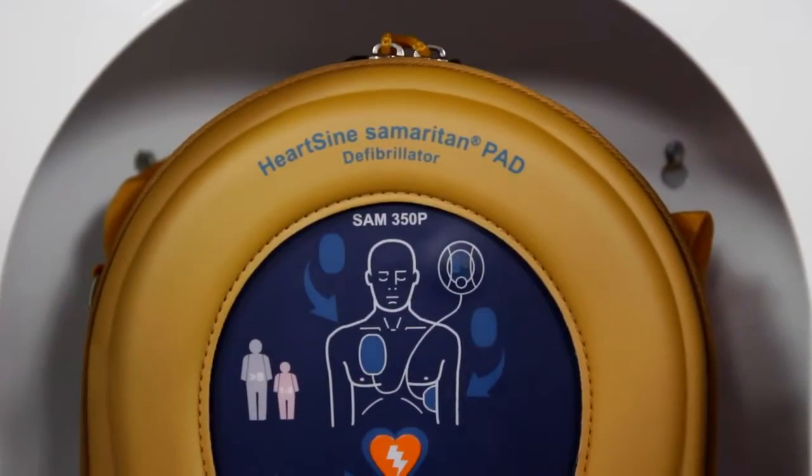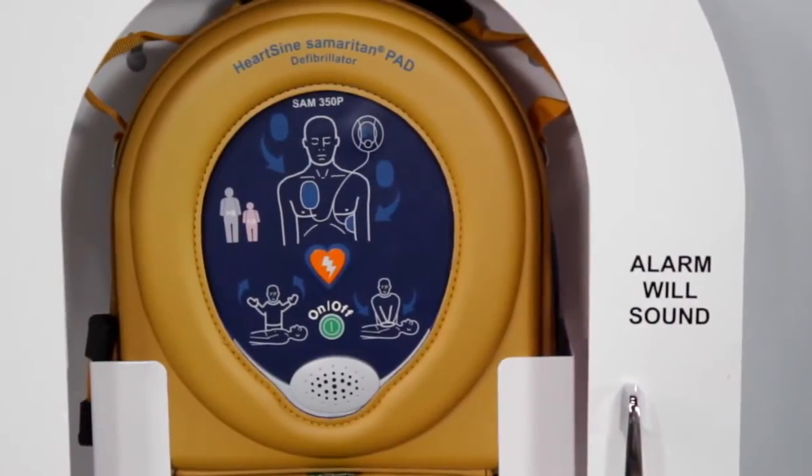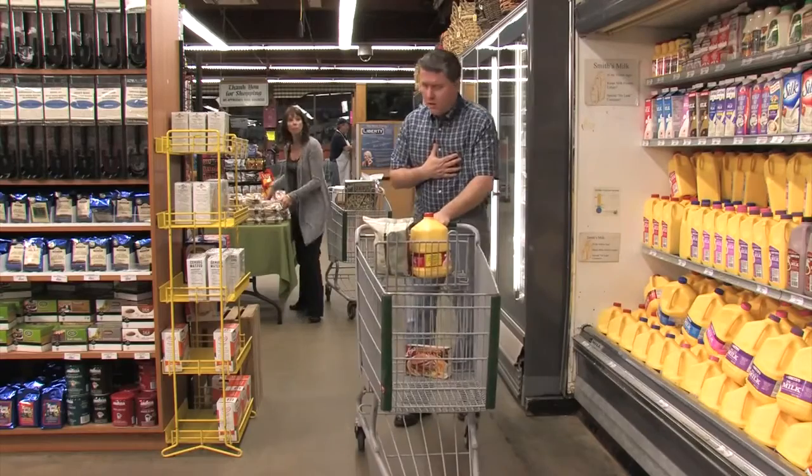You have just installed the 2010 guideline-compliant HeartSine Samaritan PAD. Now let's look at how to use one in a life-saving situation.